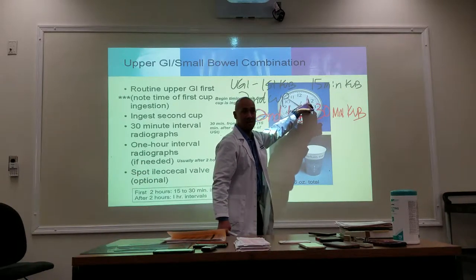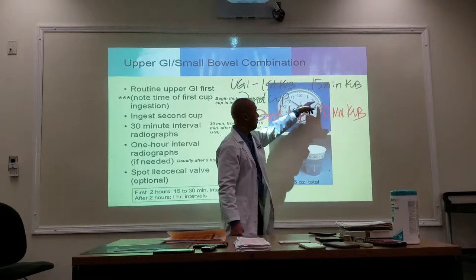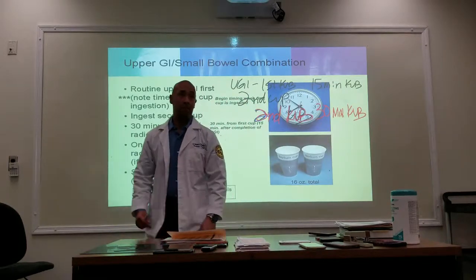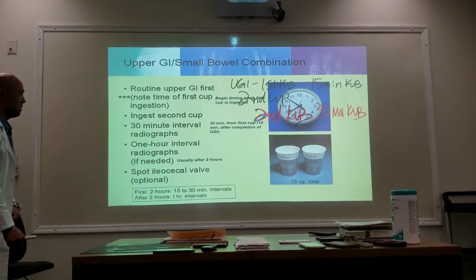So first cup is at 0 minutes? First cup is at 0 minutes. Exactly. KUB 15, second KUB 30. First at 15, the second one's at 30. And so now this stuff over here will start making sense.